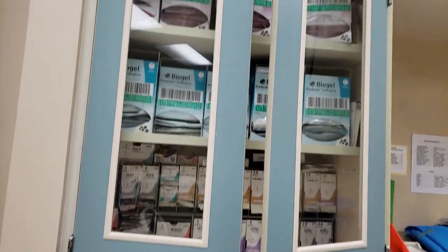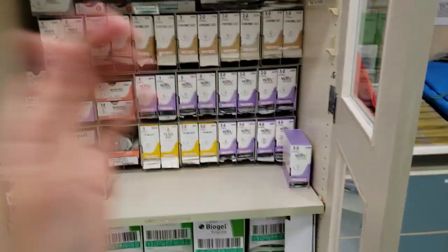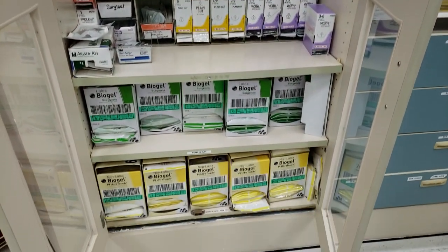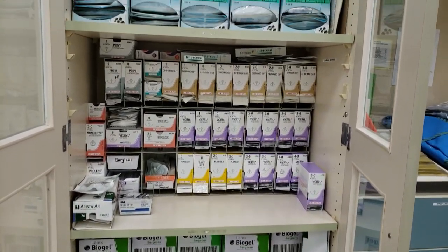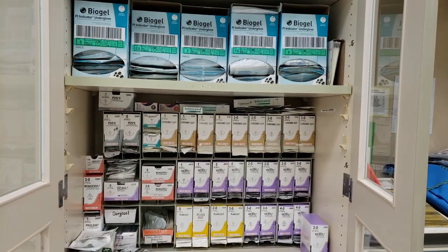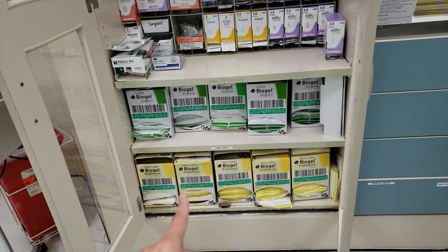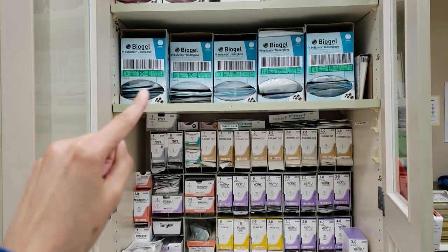This is our gloves and suture. It's actually smaller than I'm used to because in the main OR they have a whole room for all the gloves, and there's a lot of glove types that are missing here. They're missing Eclipse and some other ortho gloves, but this is basically what they use. The yellow ones are the Ultra Touch. They are latex free, and the blue ones are also latex free.